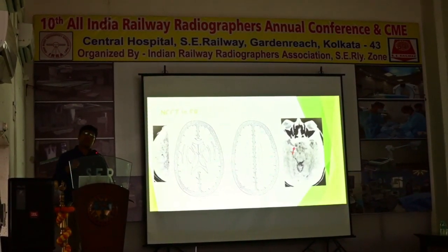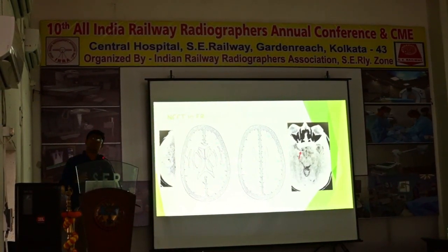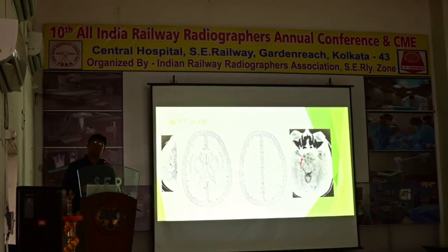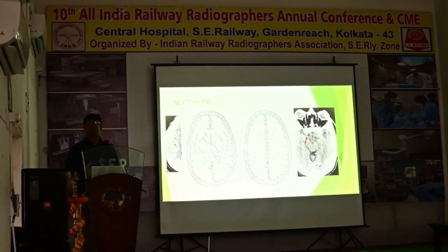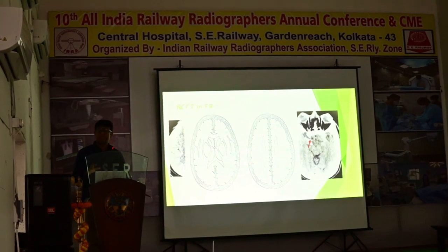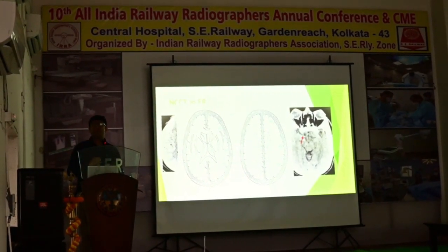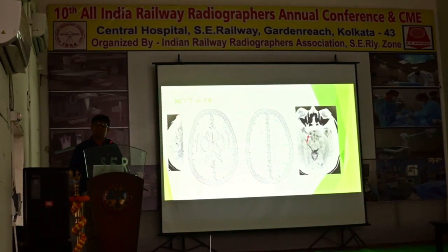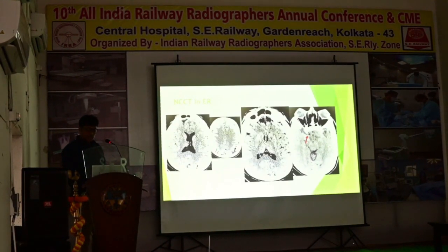So basically, it is acceptable that if it is 8 or above, it is usually a good ASPECTS. More than 6, moderate ASPECTS. More than 5, moderate ASPECTS. Less than 5 is a bad or poor ASPECTS score, which signifies that some amount of damage has already occurred prior to your treatment. So basically, if you have a good CT scan reading ability in the emergency, you do not need many investigations actually. So in this patient, we saw a CT scan, you go back to the CT.